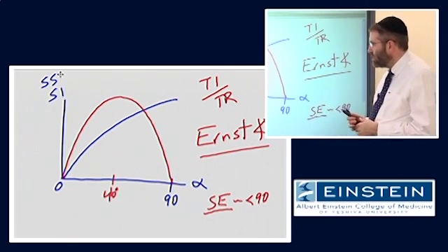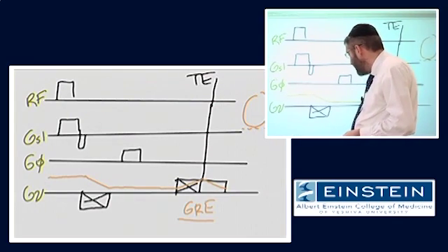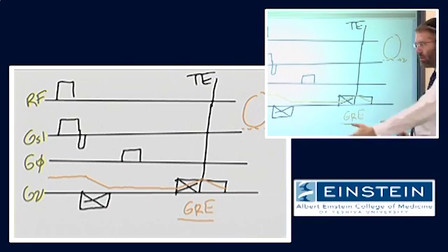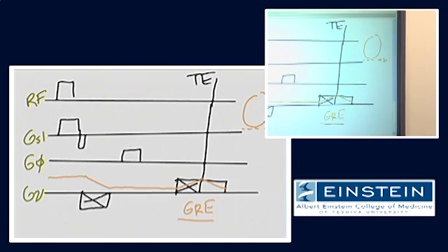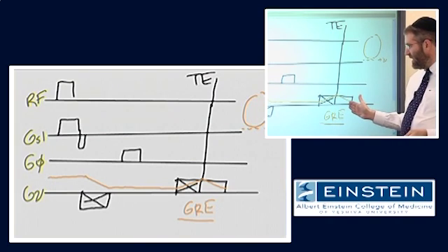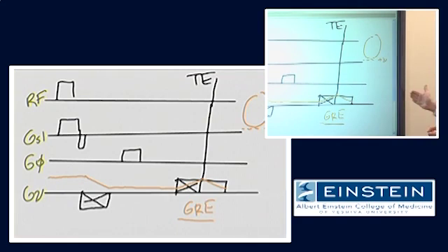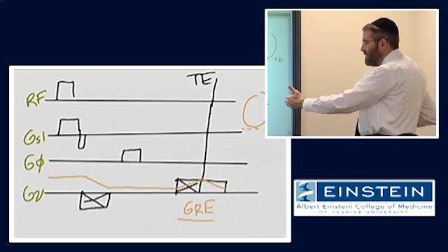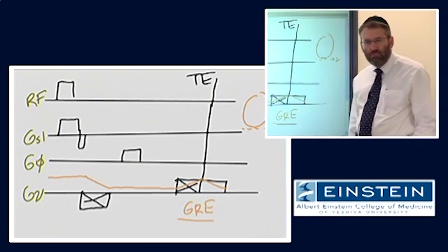And this is very commonly used in the setting of gradient echo imaging. Because in gradient echo images, we discussed the fact that, because we don't have that 180-degree pulse, we can compress this down and do all of this very rapidly. When we get to the end of TE, well, waiting until TR serves what function? Making our TR longer, or why don't we just go back right to the beginning and start over again?